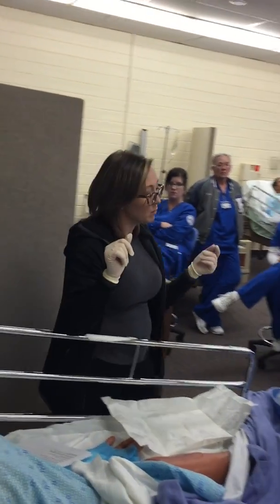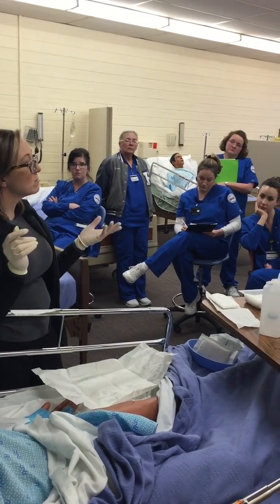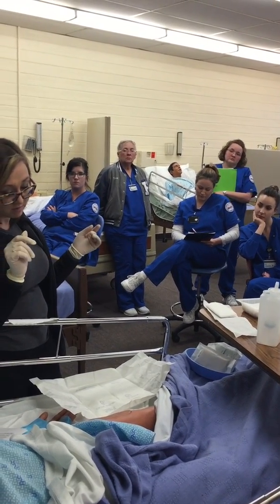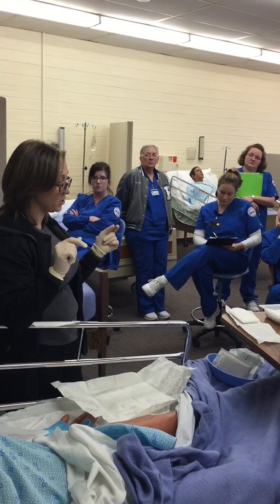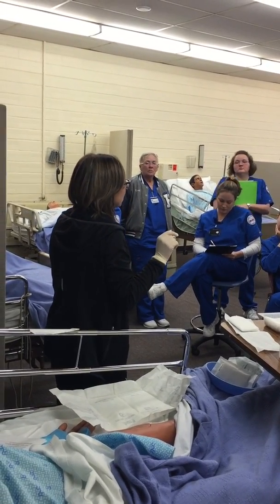No. Okay. So I have to repack my wound. So this is a wet to dry dressing change. Or, well, nah, I'll just do a regular. Well, he probably should have a wet to dry, but I'll do a regular dressing change. So make sure your instructor tells you in the beginning what type of dressing change you're going to do.